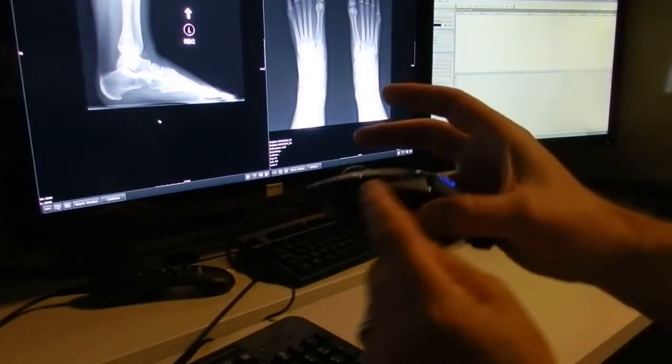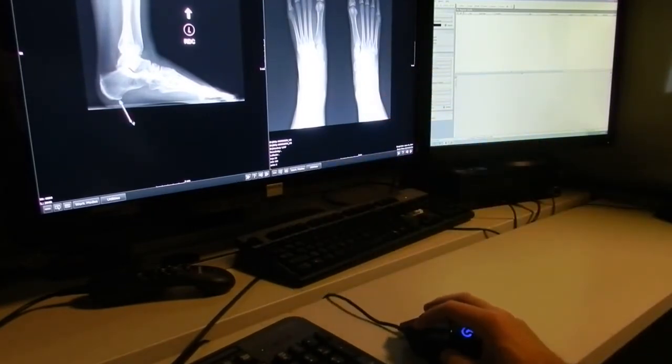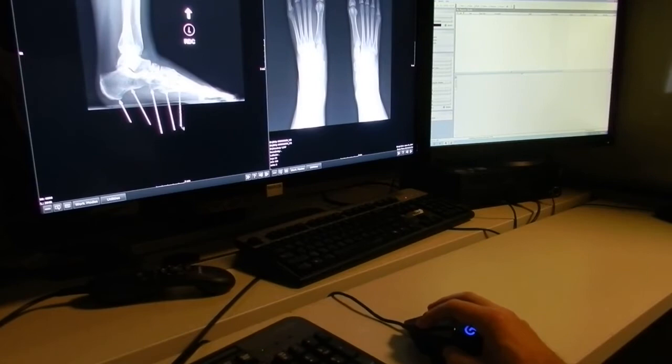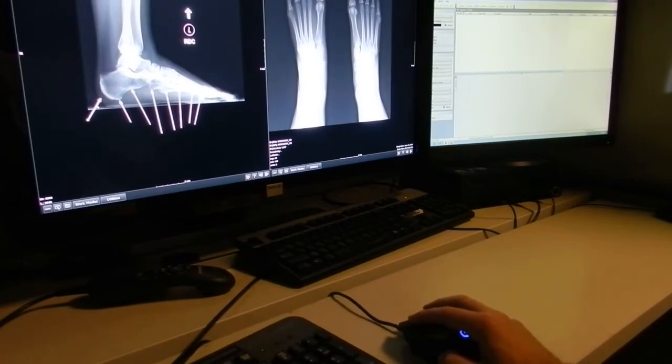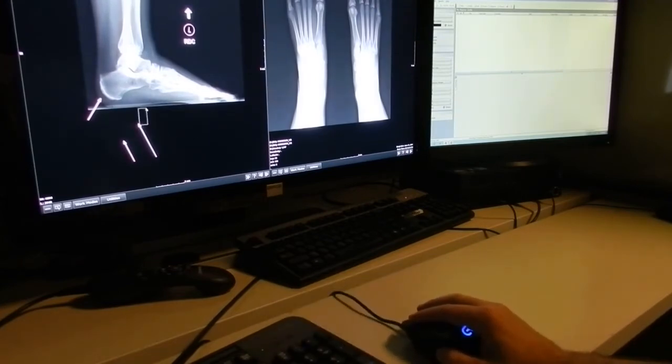The next tool is the button right behind the measurement tool. That's your arrow tool, and that's for dropping arrows. You just push down on it, and you can drop an arrow fairly easily. Good for pointing out findings to the ER. When you let go of it, it defaults to the selector tool, so you can choose your arrow and move it if it wasn't exactly where you wanted it to be, or you can grab a bunch of them and delete them. And I just figured, if you have one tool for the arrow, the next one, when it defaults back, is the actual arrow cursor, and it's easy to remember.